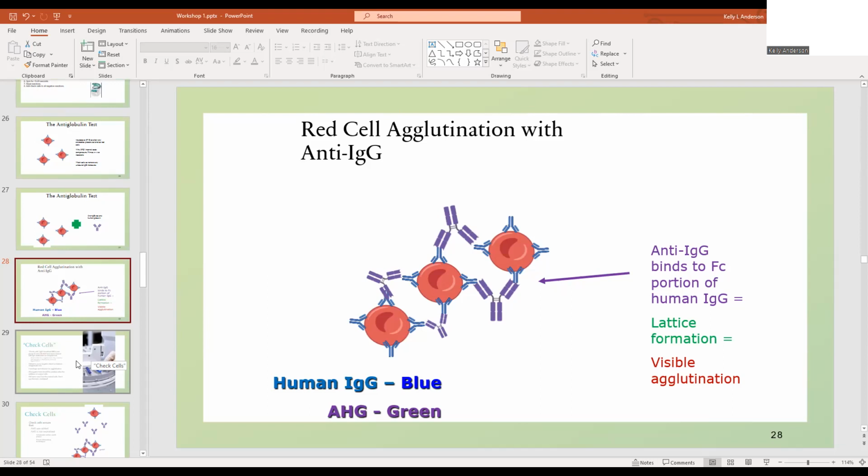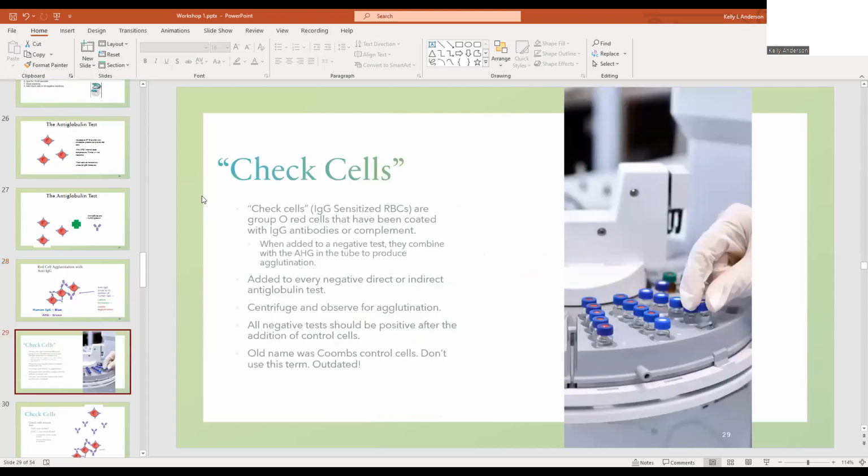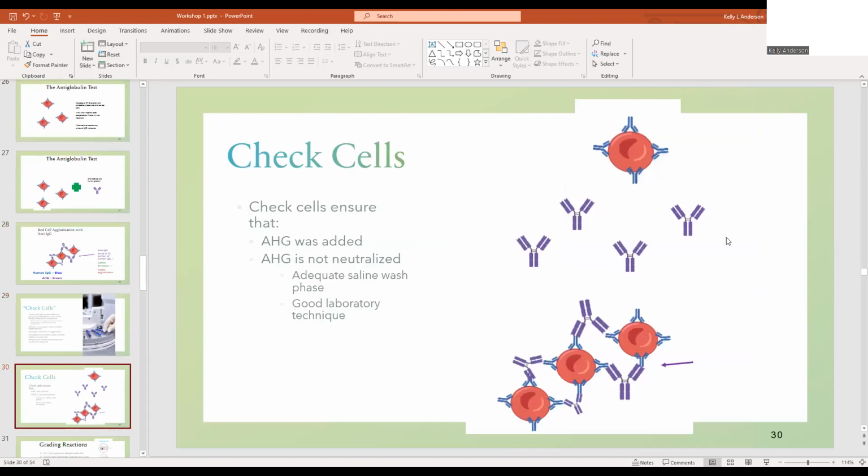So to make sure that our test worked, we add these things called check cells. So check cells are group O RBCs that are sensitized to IgG. So they have IgG sticking off. So you add those to your negative reaction cells, and you have your anti-IgG, you add your IgG sensitized red cells, and you should have agglutination afterwards.